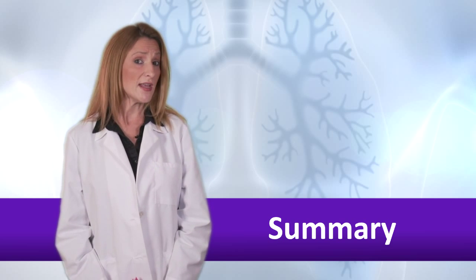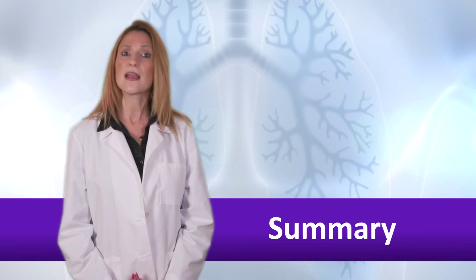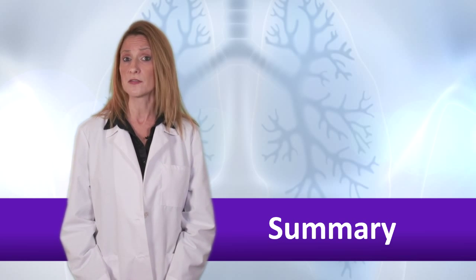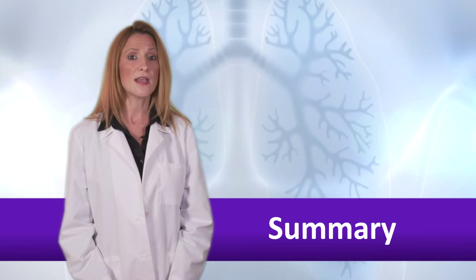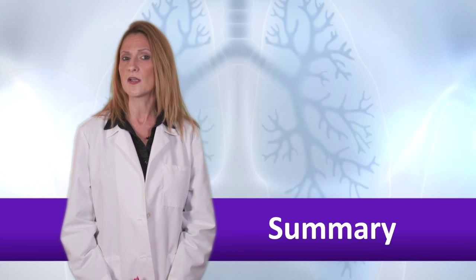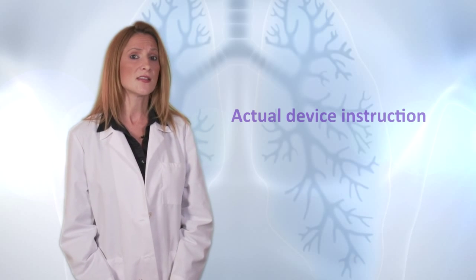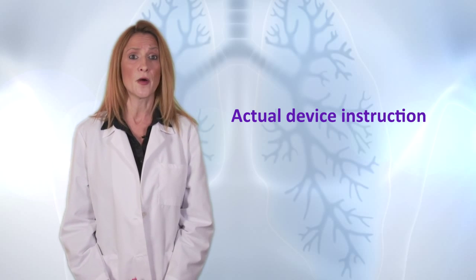What is the best way to teach patients correct device technique? Unfortunately, there is not adequate data available to know for sure. Based on what is known and our professional experience, we are suggesting a framework of the following key components. Plan for an effective session. The actual device instruction itself, which consists of several parts.